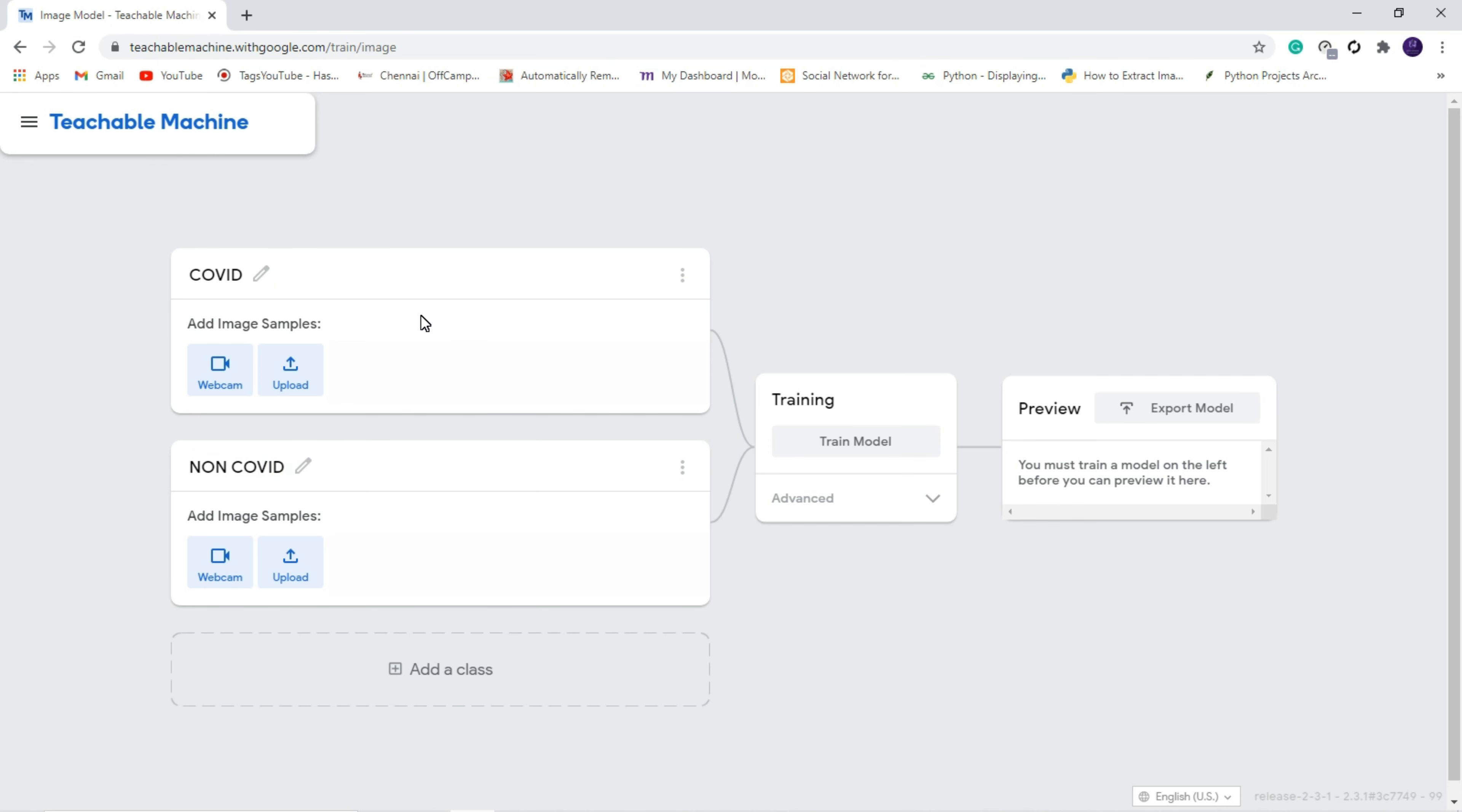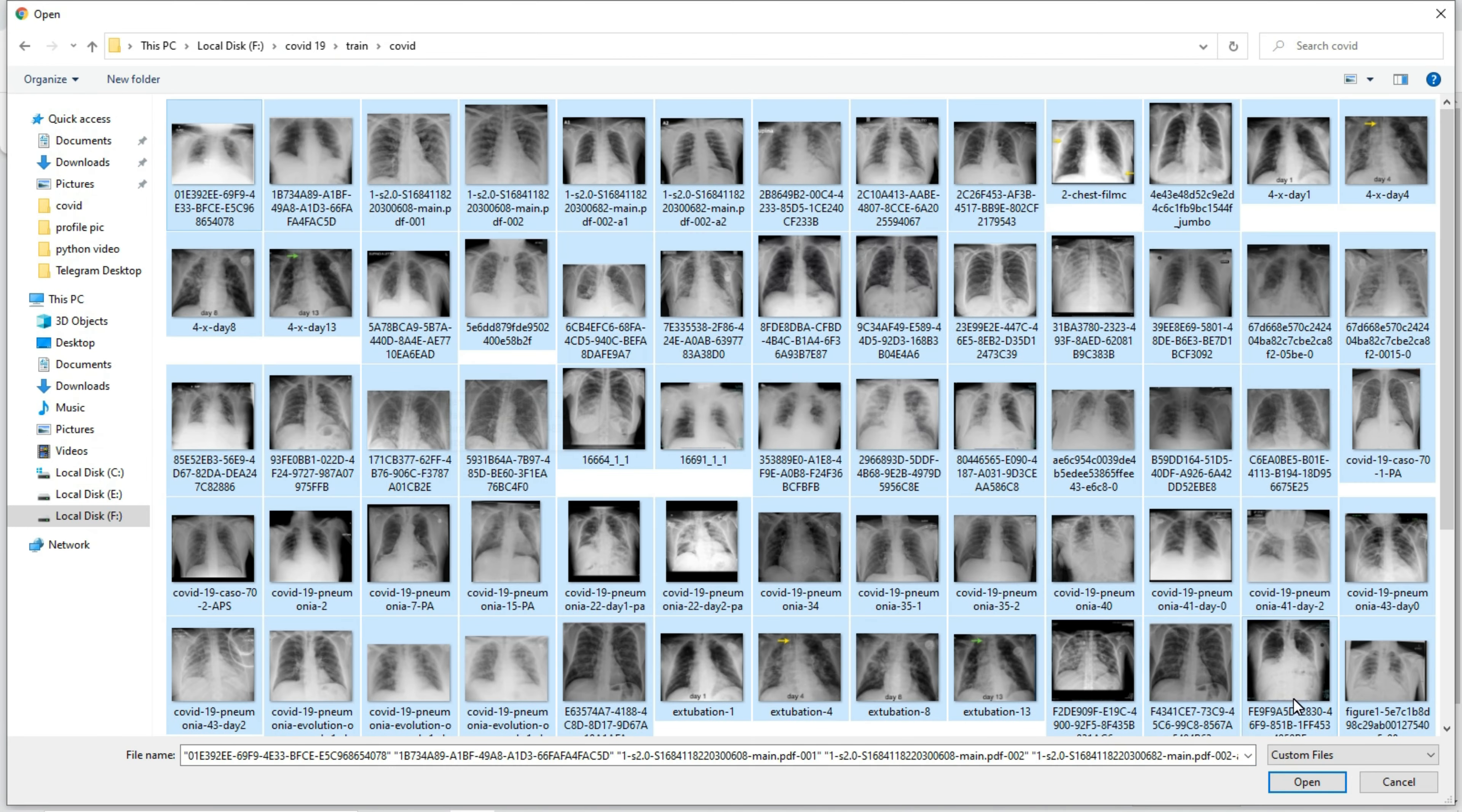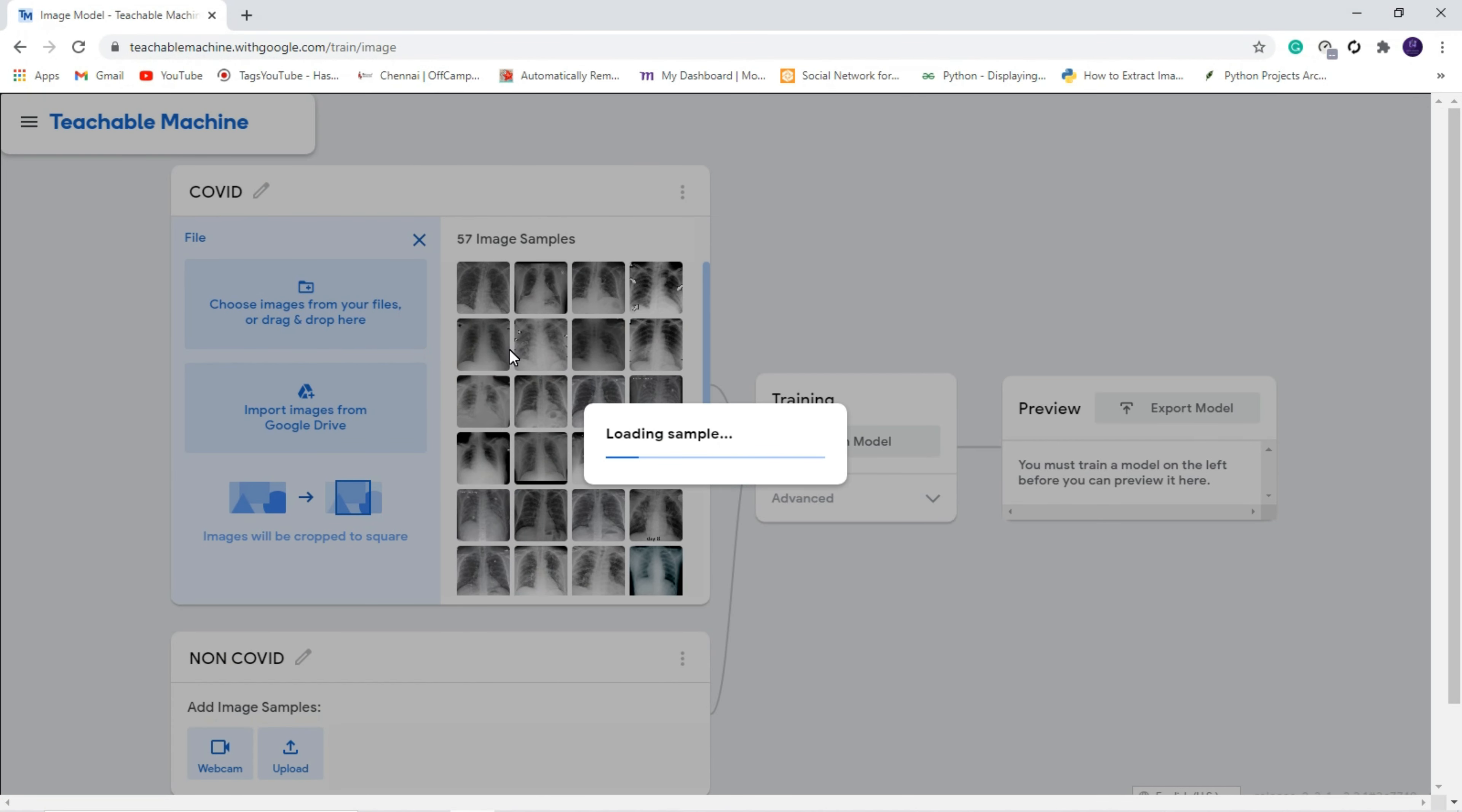After creating the class, I am going to upload a few samples for both COVID and non-COVID. That is nothing but I am going to upload some images in order to train our machine learning model. Click upload, click choose image from the files, and here first we are going to give COVID images. Here I am uploading 100 images for COVID.